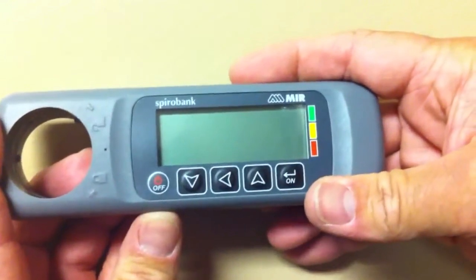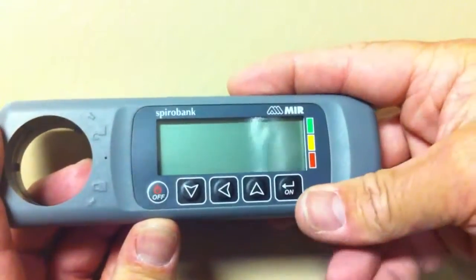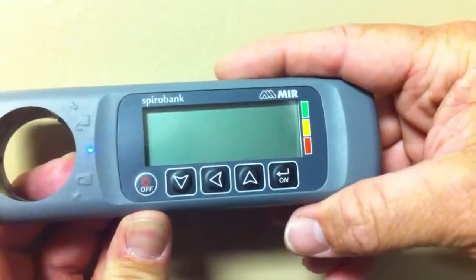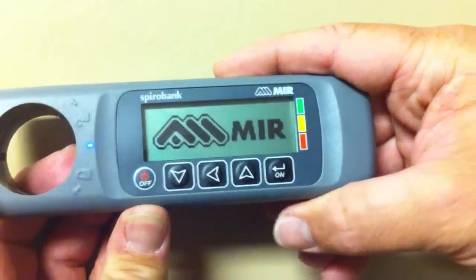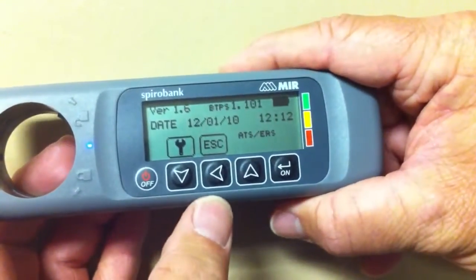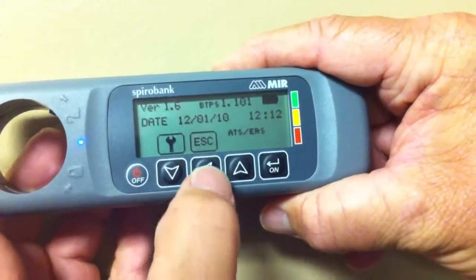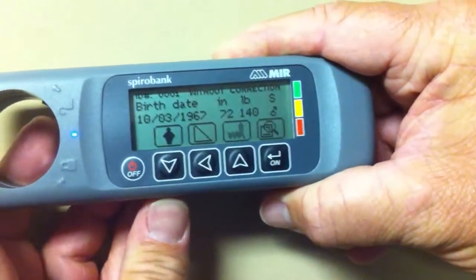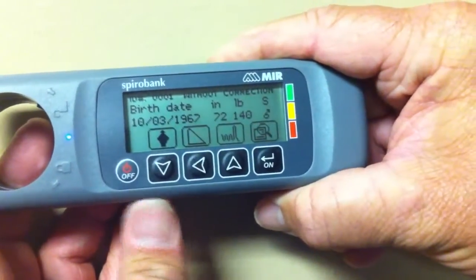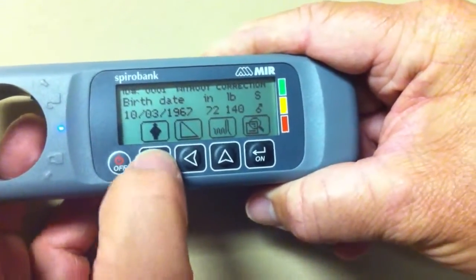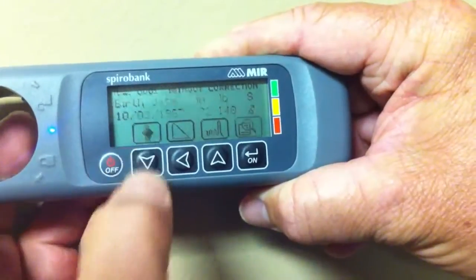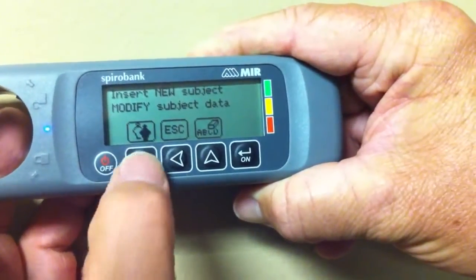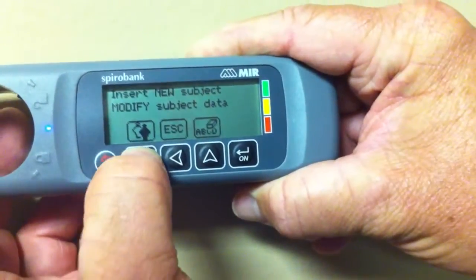Setting up your spirometry spiral bank. First, hit the on button. Choose the ESC button, which is the left arrow. Hit the down key one time, then hit the down key another time.